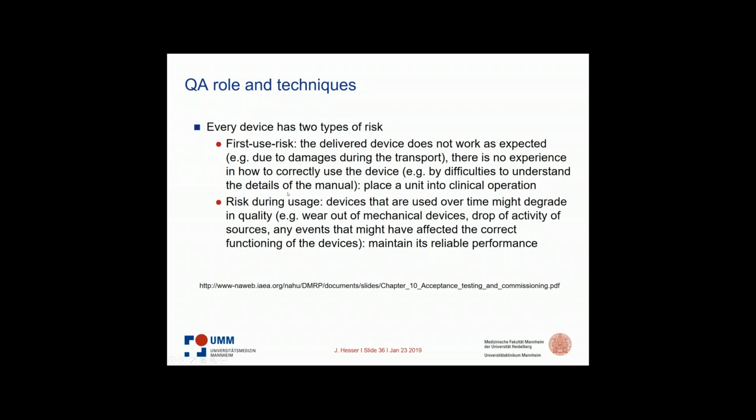Once the personnel are in the clinic and this has been used for a while, there's a different class of risks which comes during usage. The devices might degrade over time, wear out, mechanical devices, drop in effectivity of sources, and events that might affect the correct function of the devices. So what we have to do is maintain its reliable performance. So these are two issues, no? Very beginning and during the treatment. And this is just a link where this is discussed in more detail.